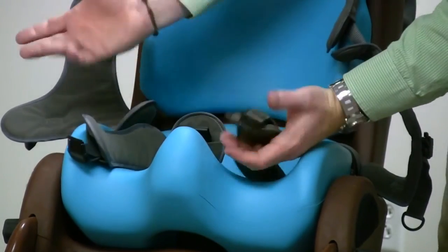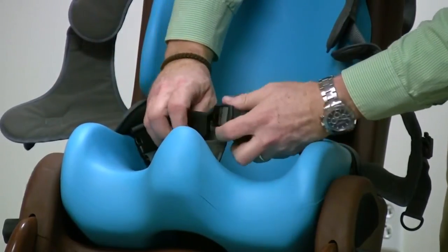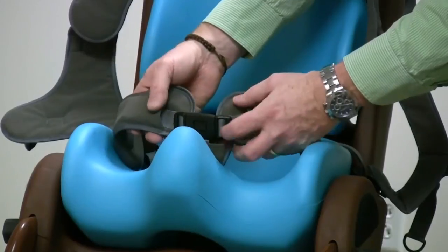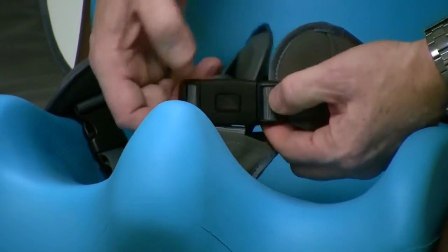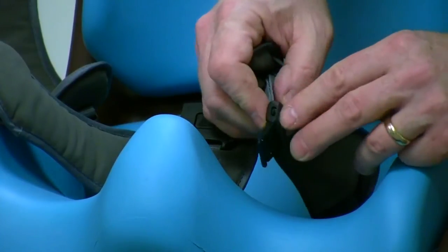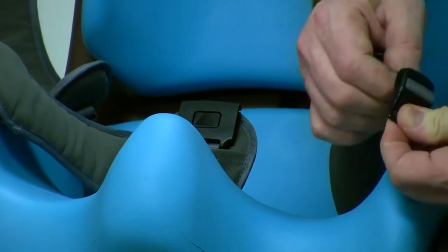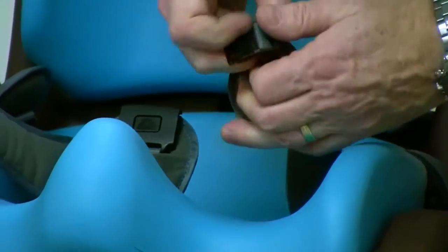That way you have one button release for both, so you can get your client in and out very quickly. Once this is adjusted to the particular person using the chair, you don't have to keep readjusting the pelvic belt — once you have it set, it's good to go. The pelvic belt also includes cam locks installed on each side, which are little locks that prevent the belt from loosening. To loosen them, you squeeze and then push up, and that loosens it up.